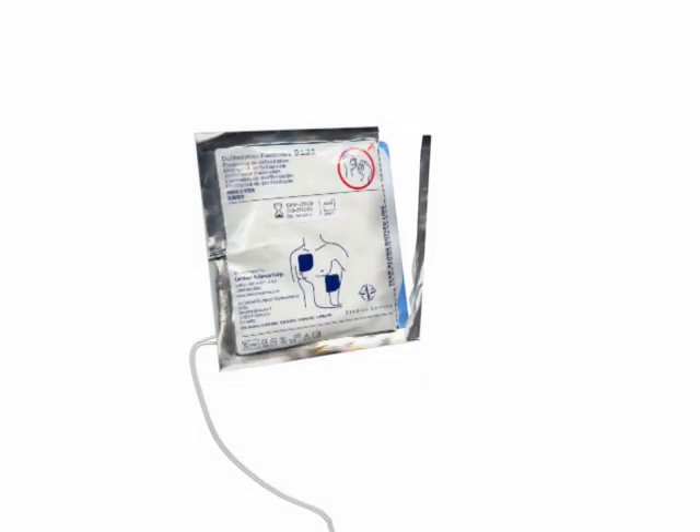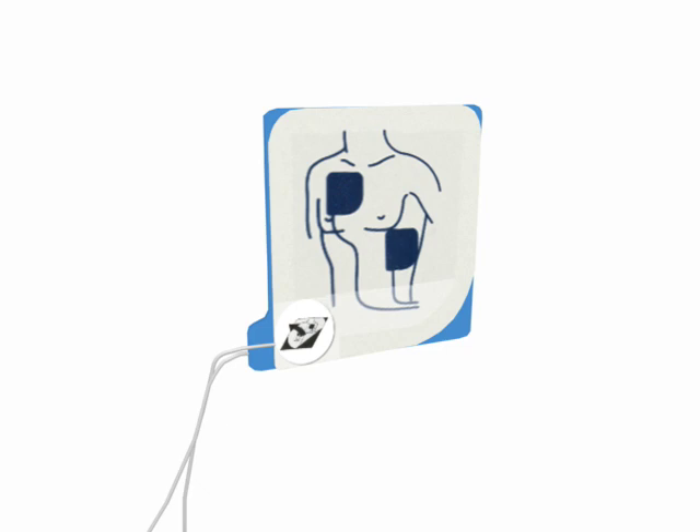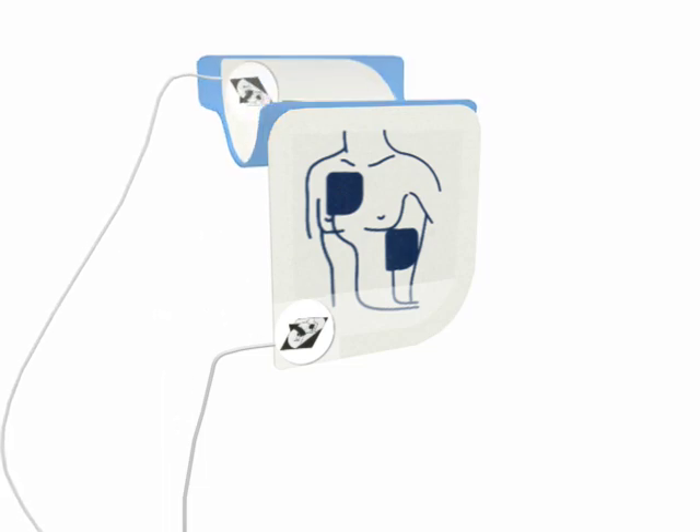Tear open foil package across dotted line and remove pads. Next, separate one of the white pads completely from blue plastic liner. Begin peeling from the tabbed corner.